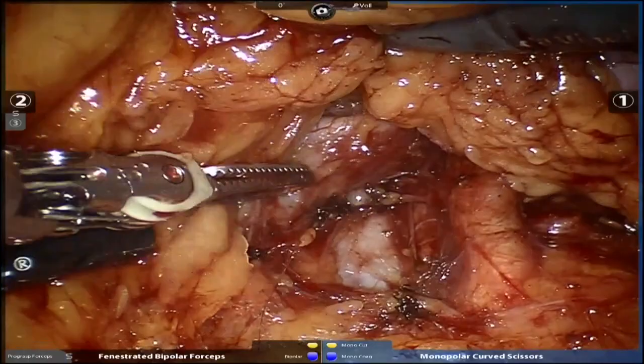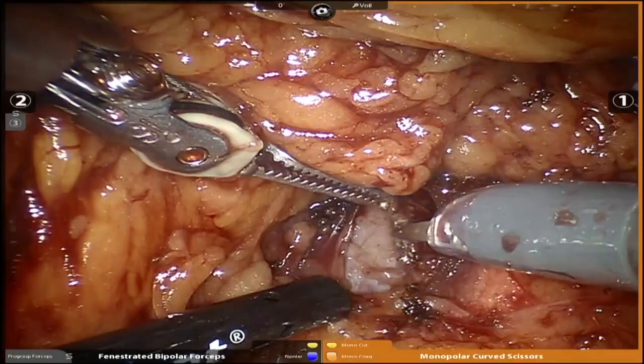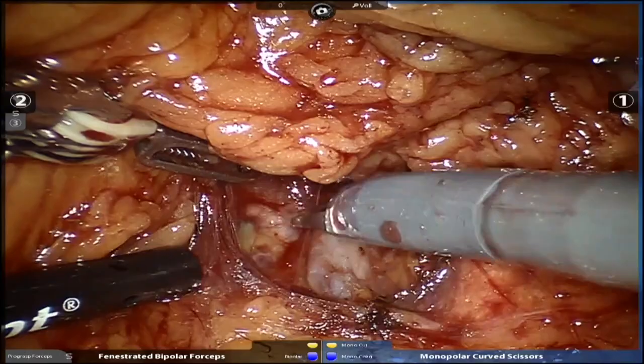We have a very nice model. Yes. We have a beautiful 3D printed model, which shows pretty complex vasculature, mainly complex veins. And the model has been extremely helpful. I think this is the same group from Orbassano from Torino. Amazing view today of the anatomy. So again, I'm getting the vein exposed here.